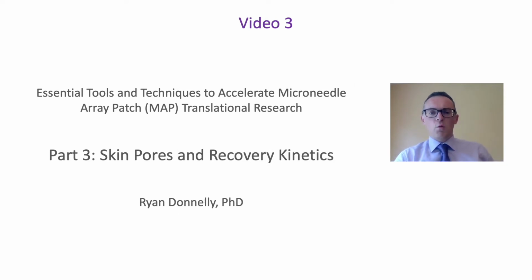So in this video, we're going to talk about the skin pores created by microneedles and also how the skin recovers after a microarray patch is removed. This is really important because what we want is a delivery system that's easy to use, that reproducibly penetrates the skin, but also that is pain-free and allows a fast skin recovery.